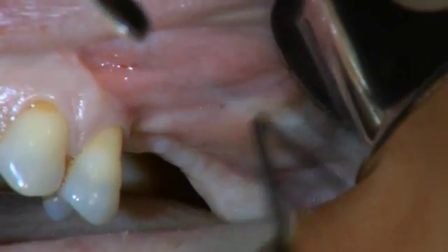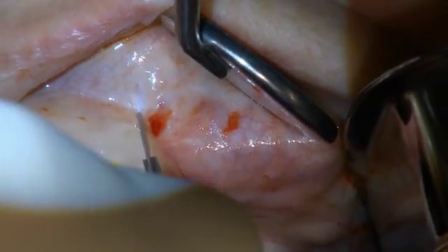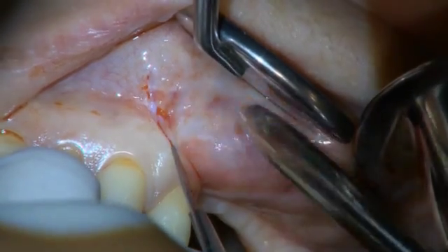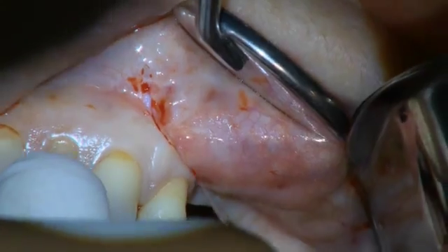Here we see the consequences of a previous bone graft: a mucogingival distortion, loss of the vestibule, and no keratinized tissue. To improve the soft tissue situation, we perform a combination graft utilizing a strip gingival autograft with Geistlich Mucograft.